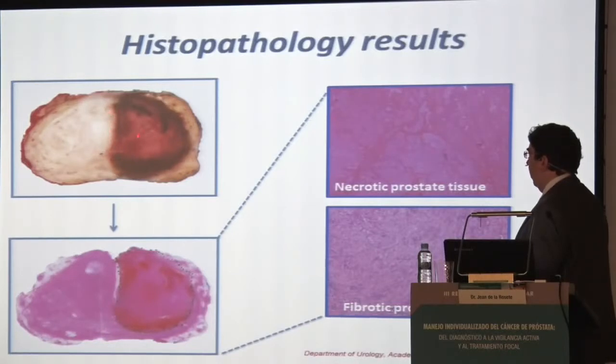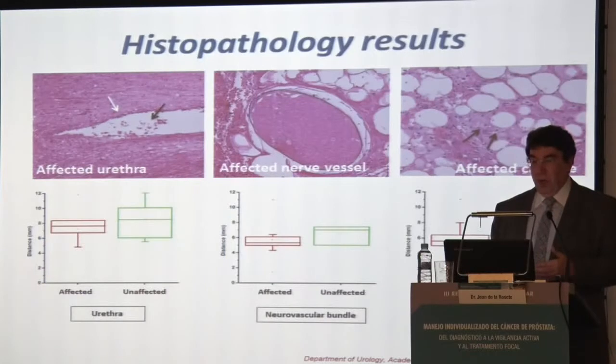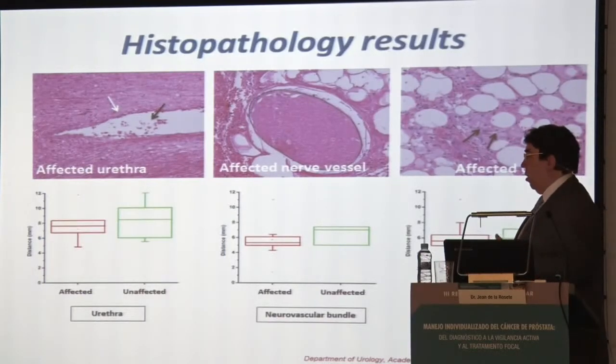But of course, if you would have a tumor here and you would have treated it, all of it was erased. And the other thing which was important, you can see very sharp demarcation. We did a similar study, as I said, with HIFU, and then you would have these irregular borders. And that's where it was not always sure that you could nicely predict the area that you were going to treat.